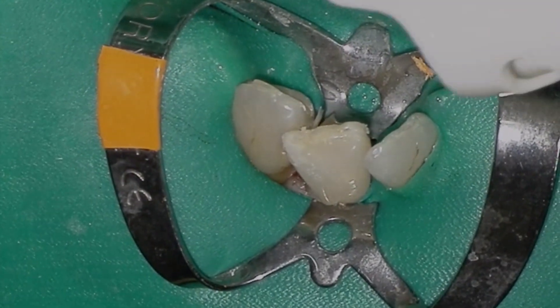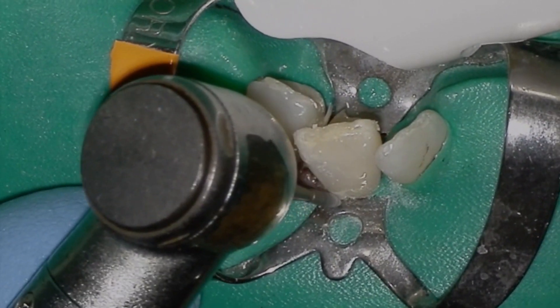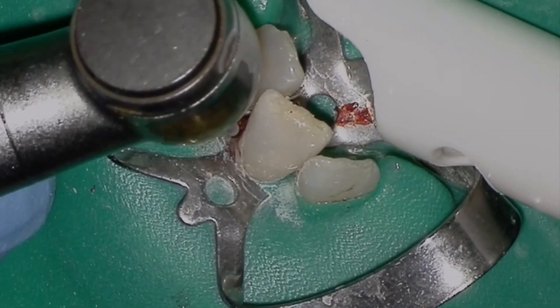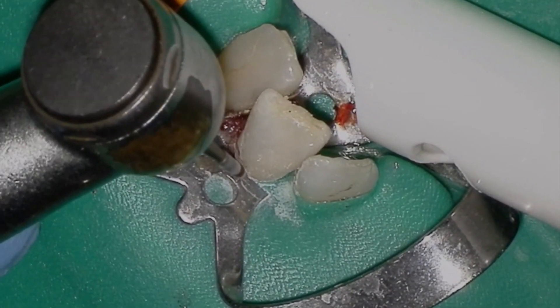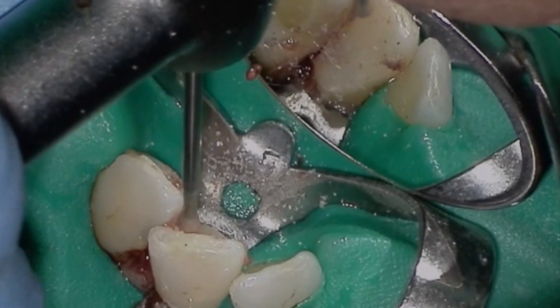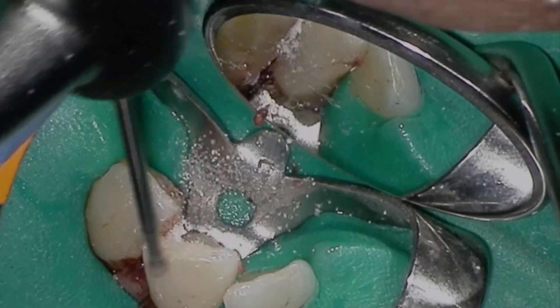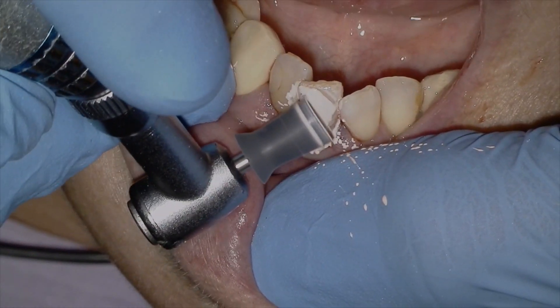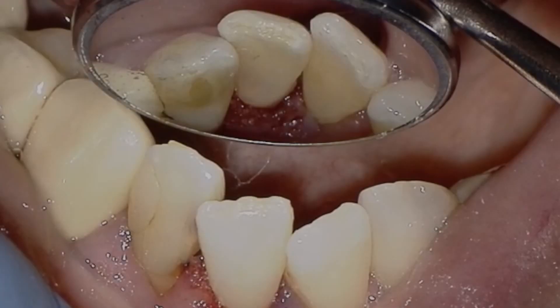We've light cured and now it's time to finish. I try to keep the rubber dam on for as long as possible — it just speeds everything up by keeping the lips and cheeks out of the way. This is just basic finishing with a flame burr. The long shank Munce burr was super helpful because I could see what I was doing and the head of the handpiece wasn't in the way. Now we're using diamond polishing paste to give it a nice quick finish. Essentially, we're done within about an hour.